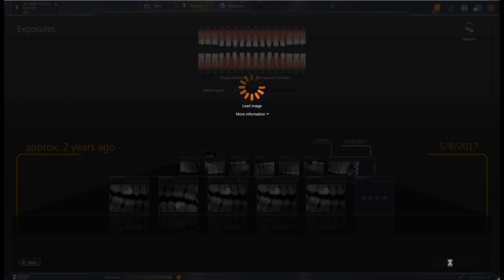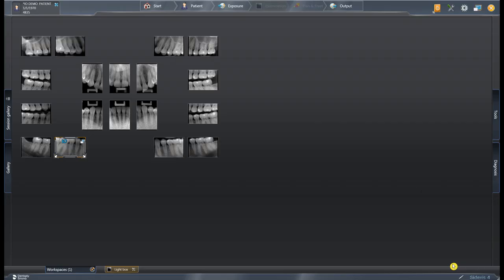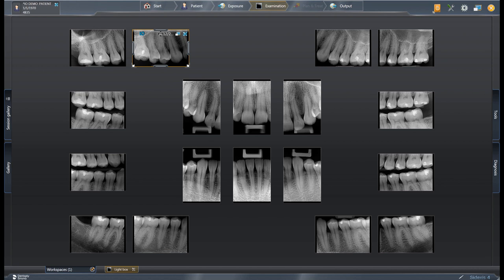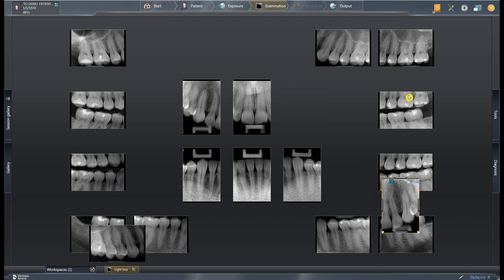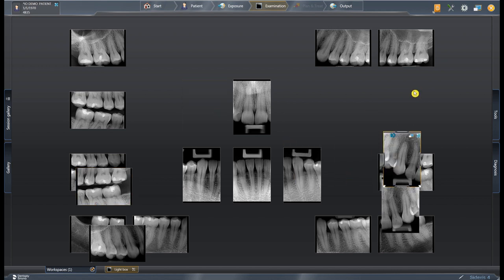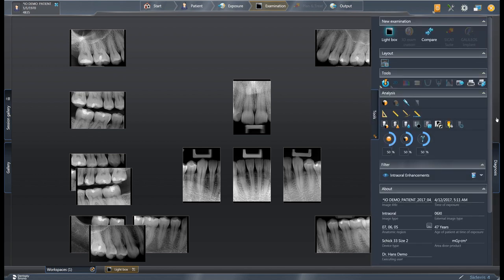We have our images open and this is our basic FMX format. If I want to move some of these images, click on an image and hover on the middle upper portion until you see the four-arrow crosshairs, then click and drag to move them wherever you'd like. If you've made a mess of things and want to snap everything back to its original position, go over to the right-hand side under Tools, expand the toolbar, and under Layout click the one button — it will snap everything back into the original template position.